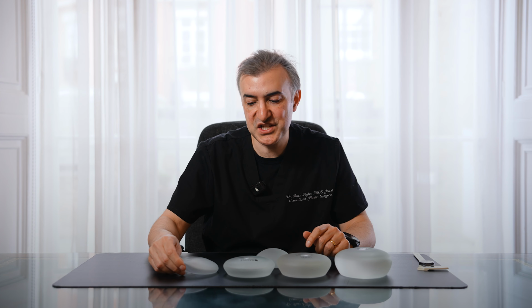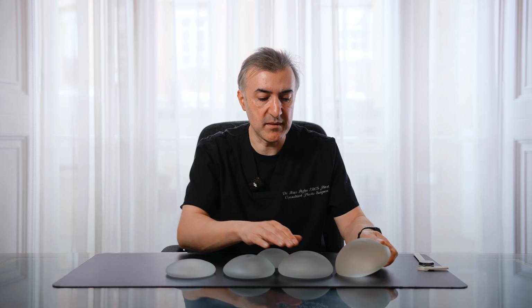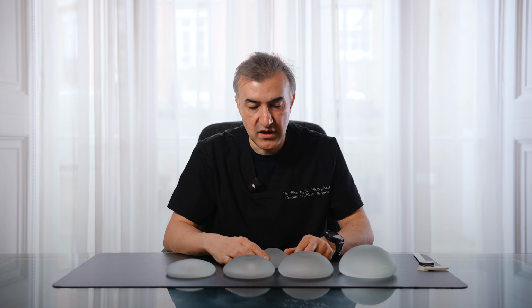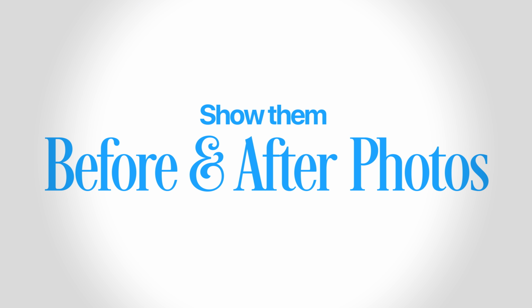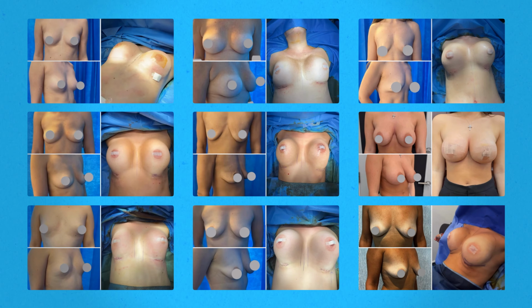And in addition to going through the different projections and sizes of implants and trying them on, the other thing that you do is show them befores and afters. So we've got pictures that we can look at, we've got the website, we've got Instagram, and you can have a look at how they actually look, different CCs.